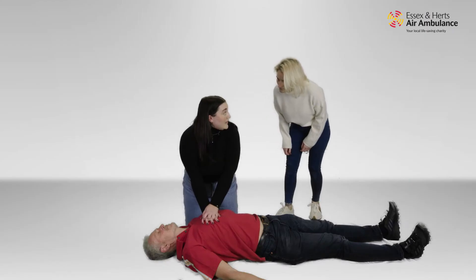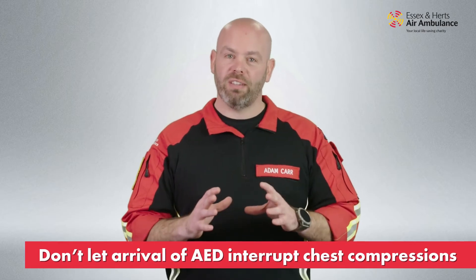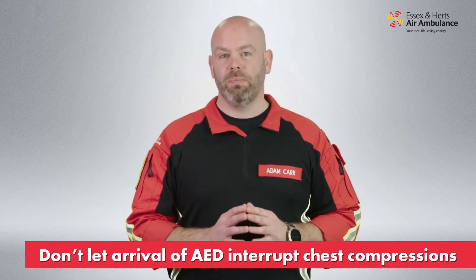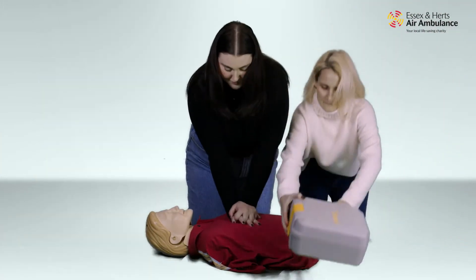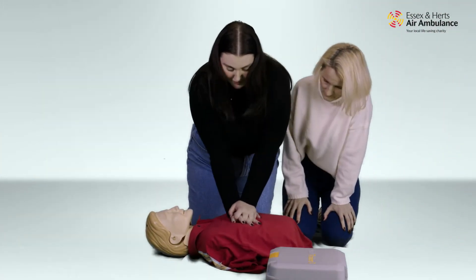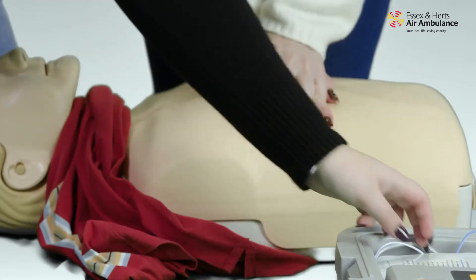When the second rescuer returns with the AED, it's really important to remember it cannot get in the way of chest compressions — stay on the chest and let them work around you. They need to remove any clothing covering the patient's chest area because the pads have to stick to skin. If clothing can't be removed easily, there will be a pair of scissors in the box to cut it.